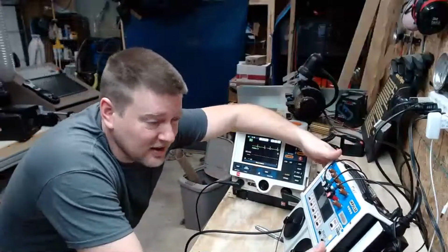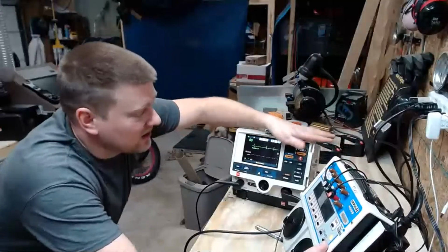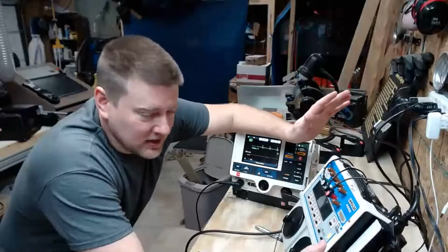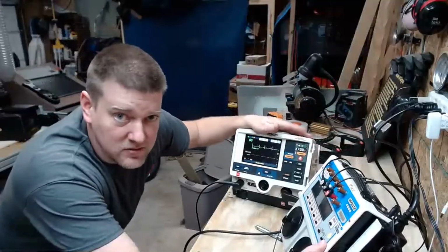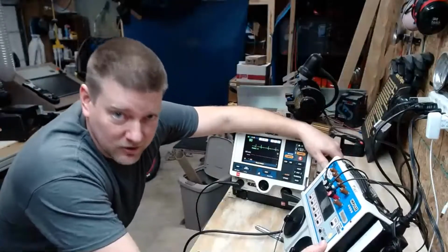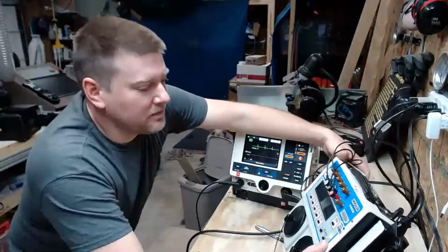Now, the older LifePaks, they used to get easily up around 50 to 55 milliseconds, because the LifePak 12s, the LifePak 10s, the larger giant models, those ones, they just took their sweet time to do what they got to do. These newer ones, they're way faster. The Zoll defibs are even faster than this. They're like 10 milliseconds, 12 milliseconds. This one here is at 24. It's well within the spec. So the American Heart Association suggests 60 milliseconds.